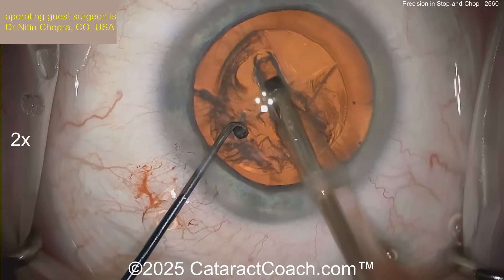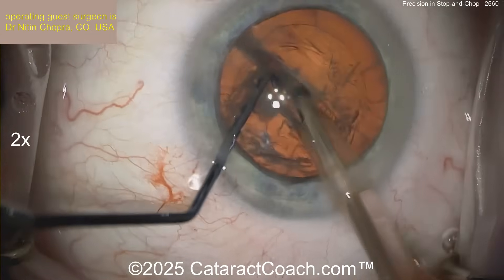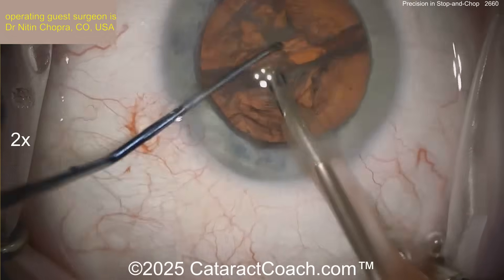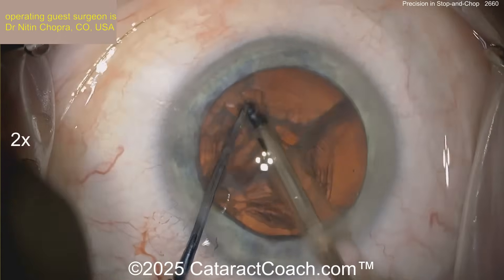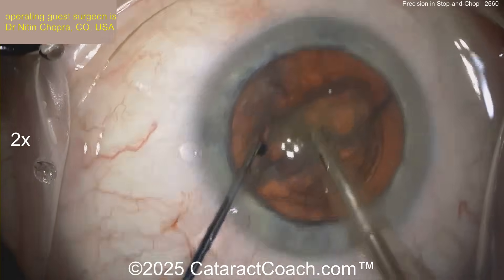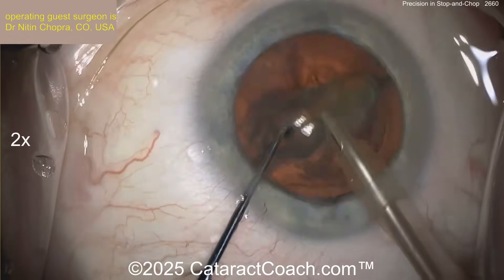Deeper in the center and thinner in the periphery. Look at that — just a few passes and already a nice chop or crack right down the half. Making sure you fully propagate that, and a nice rotation here. A little bit like a divide and conquer perhaps — you can definitely do a divide and conquer. Let's take that first piece out, and then perhaps the second half of the nucleus will be done with the chopping technique.